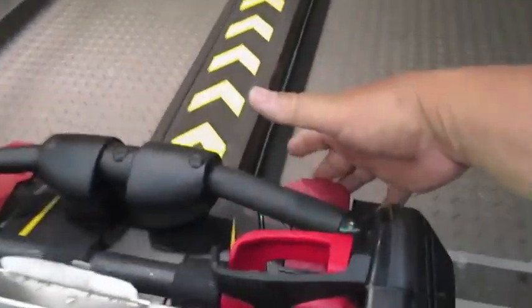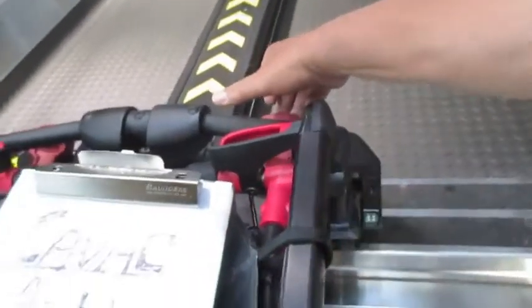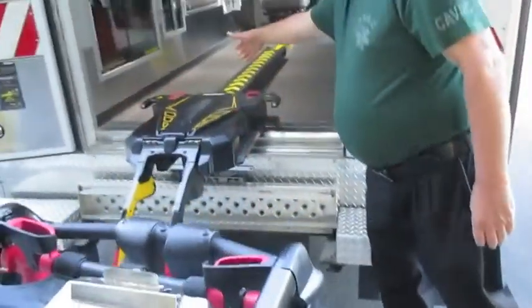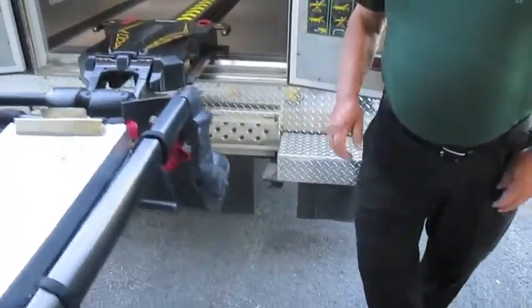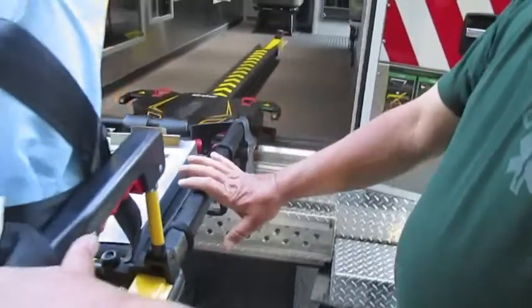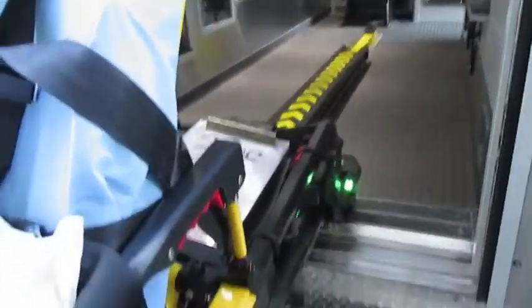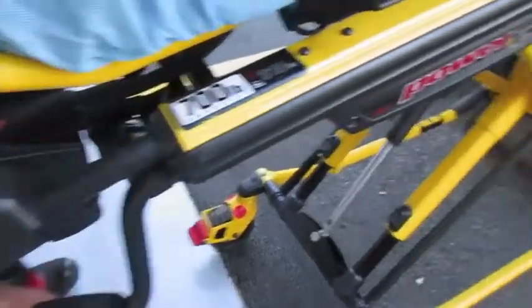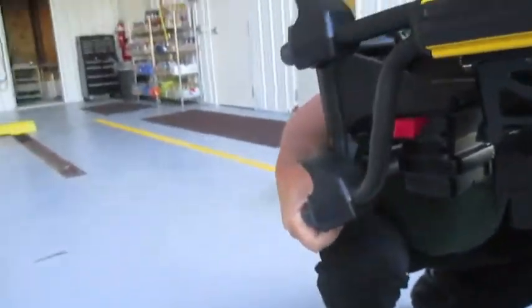We're going to use the release here, which will flash our light, and let us pull it away. In reverse, it's connected and still works even though the stretcher is dead. We're going to use the release again in this case, and we're going to lift manually.